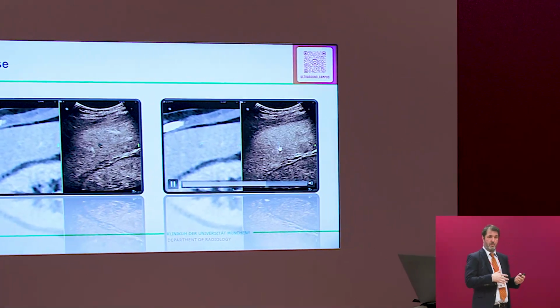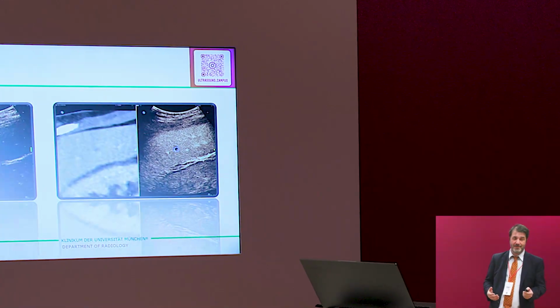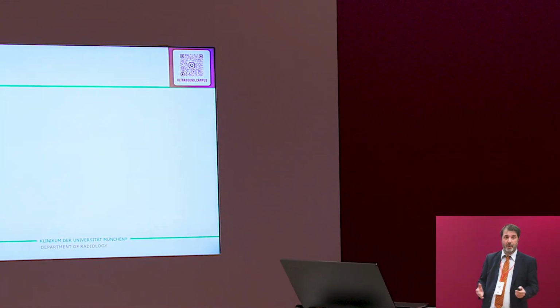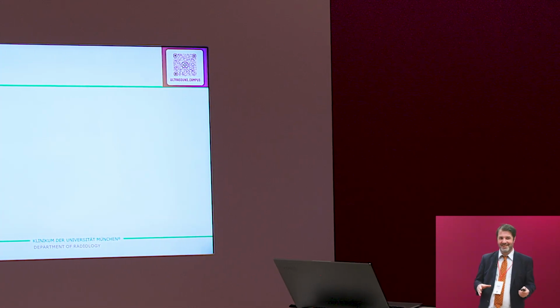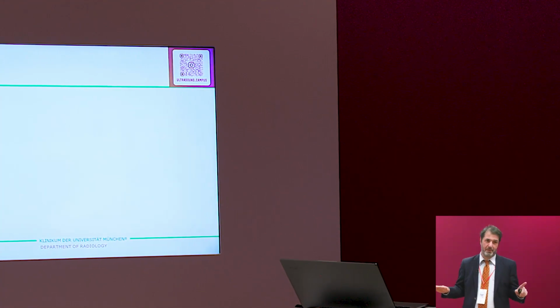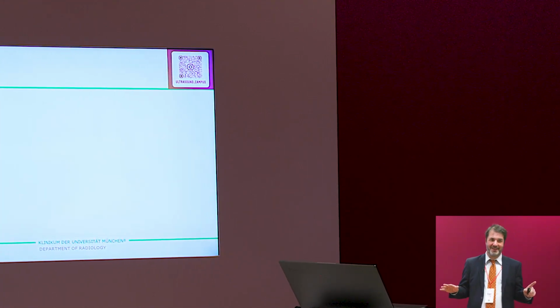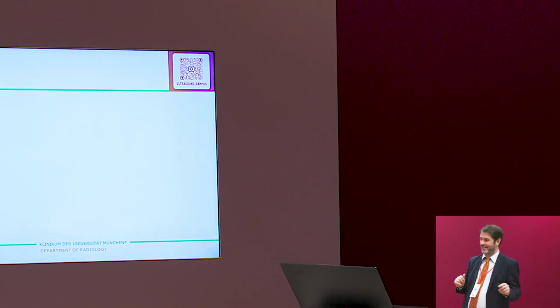Even a lesion without any uptake will be what kind of lesion? No uptake, no contrast inside. No contrast during the whole examination, so not alive. This is a cyst. Yeah, you got it.